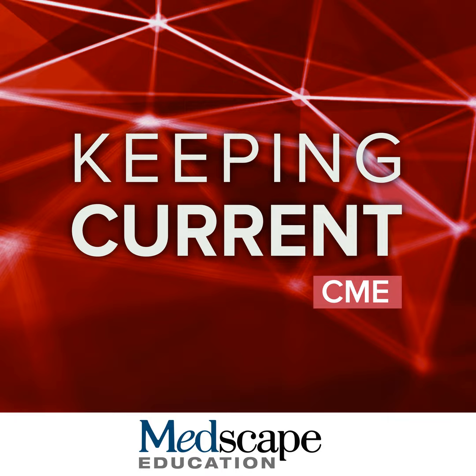My own experience is that the Z-scores are extremely helpful when you're looking at the FDG PET scans, because those are harder. They don't have a standardization like a centiloid to put with it. And the Z-scores can also be very, very helpful in my own experience with tau PET, because you're trying to look at regional values within the tau PETs. I think for the amyloid PET scans, though, the centiloid is the quantification that was used in the trials, and so is what I would personally recommend.